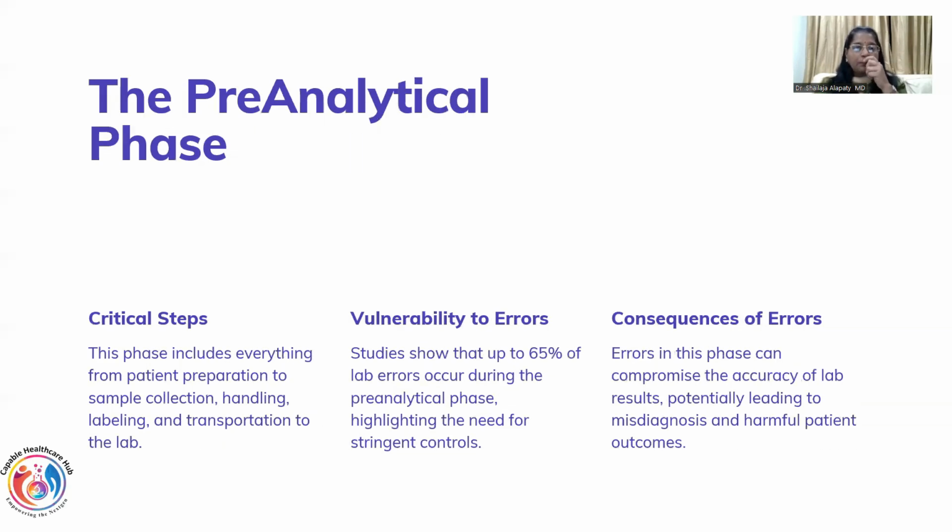Now, the critical steps: patient preparation, sample collection, handling, labeling, transportation. At every level, only if we are correct will everything be correct. Otherwise, we are vulnerable to errors.